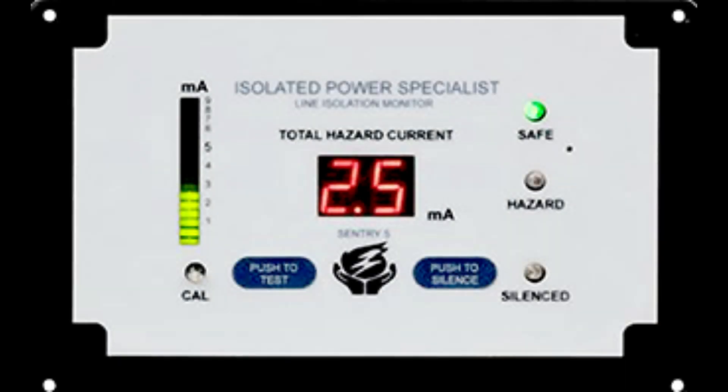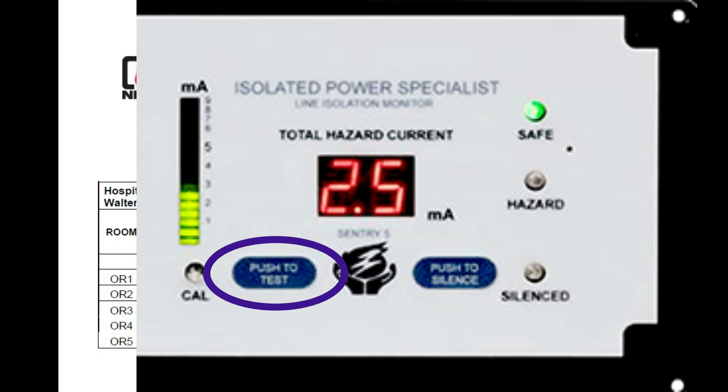The newer LIMs, like this one, are called digital type LIMs, and they test themselves daily by an internal program. If they fail their daily testing, they will audibly and visually alarm with a failure code on the LIM's display. This type of line isolation monitor should be tested annually by pressing the push-to-test button. The results should be recorded on a test form like this.